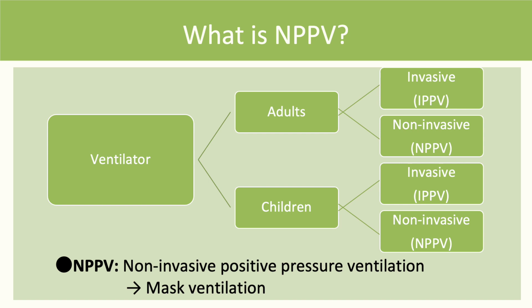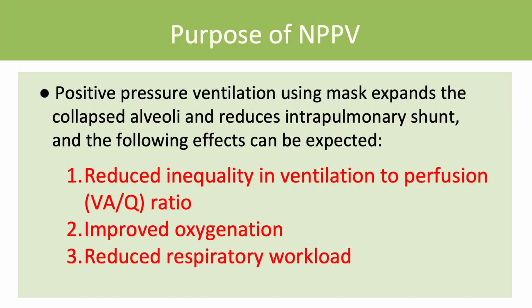NPPV refers to non-invasive positive pressure ventilation therapy, which mainly represents mechanical ventilation using a mask. Non-invasive ventilation for children is also referred to as NPPV. The purpose of NPPV is to improve non-uniform ventilation, blood flow and oxygenation, and reduce respiratory workload by expanding collapsed alveoli and decreasing intrapulmonary shunts through positive pressure of mask ventilation.